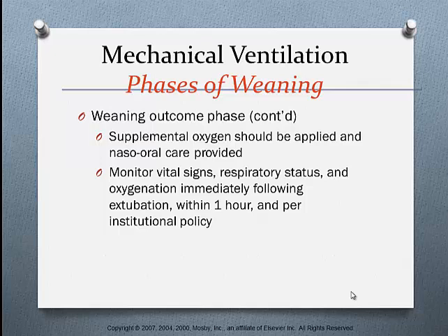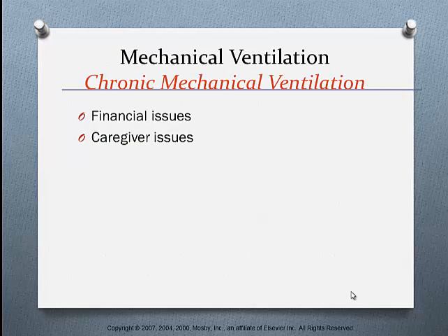You want to monitor their vital signs, respiratory status, and oxygenation following extubation within 1 hour or by your institution's policy. You also want to make sure that you have intubation equipment and a ventilator still close by until the patient is past that initial period. Some concerns that patients may have after they've weaned from the ventilator are financial issues or caregiver issues.